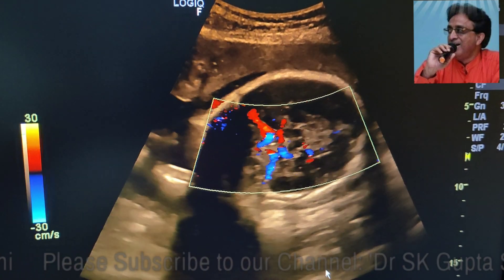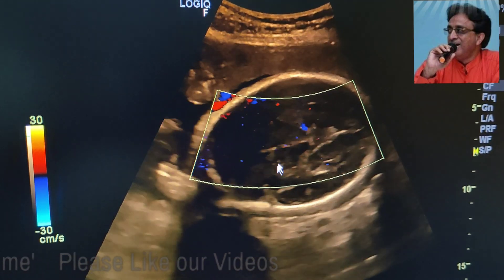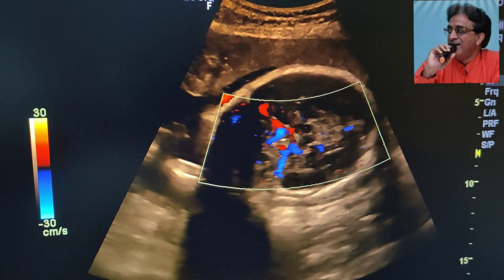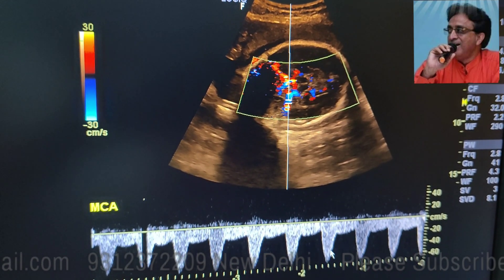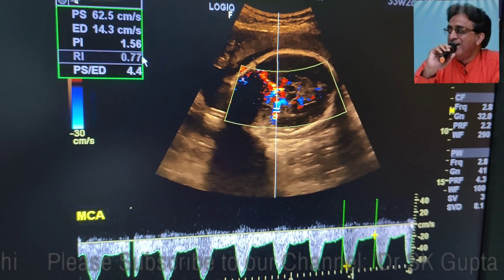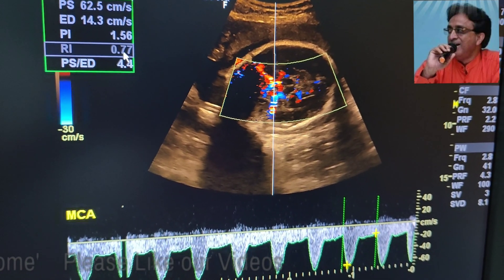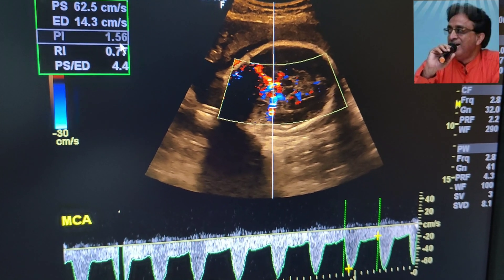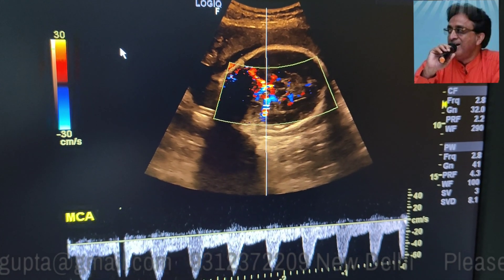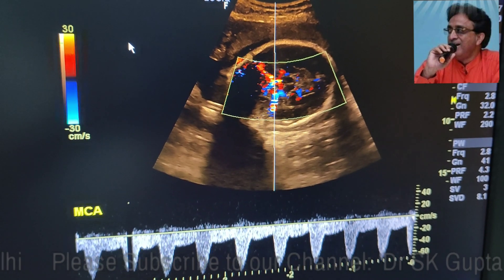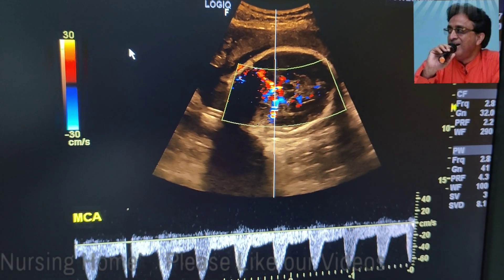Now measuring the color Doppler scan of the middle cerebral artery — you can see this is the circle of Willis and this is the middle cerebral artery on one side and on the other side. When we measure the cerebral artery flow, we find that the resistive index of the middle cerebral artery is decreased. Usually the resistive index of the cerebral artery is more than 0.8, but here it is decreased and the PI is also decreased. This means there is a cerebral sparing effect because of the decreased vascular supply, which suggests that the fetus is in IUGR and this fetus should be saved.